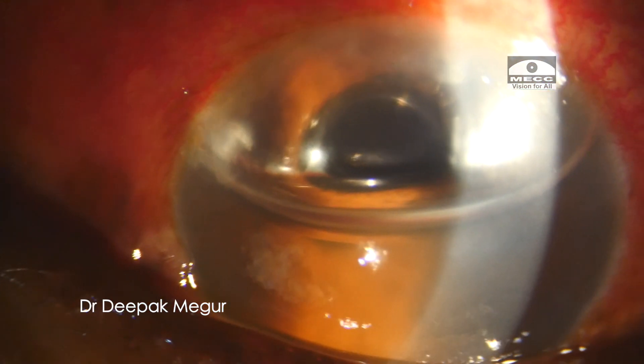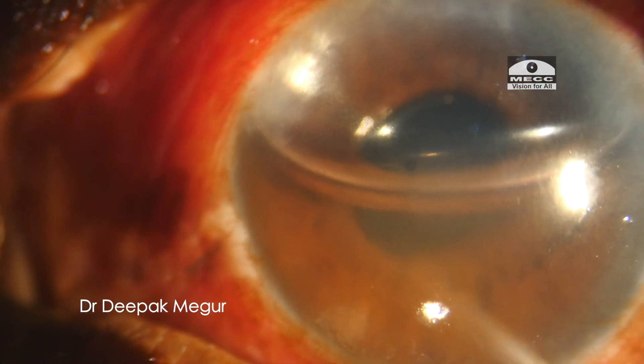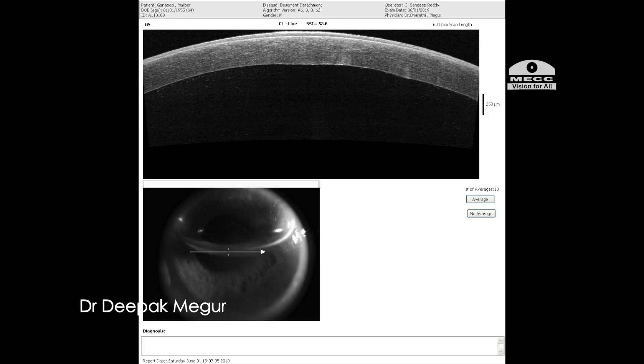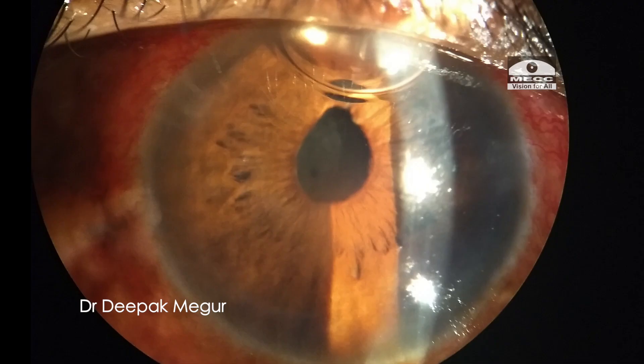In the first post-operative day, this is how the eye looks. As expected, there was corneal edema, but there is still air available which is supporting the small Descemet's membrane detachment. The corneal OCT was done and confirmed the Descemet's membrane was attached. Eventually the cornea cleared up and the patient did pretty well.